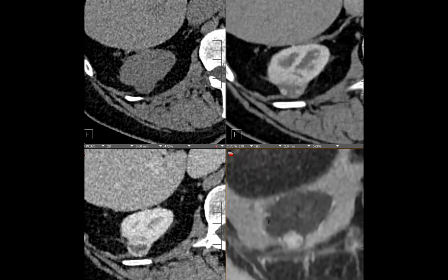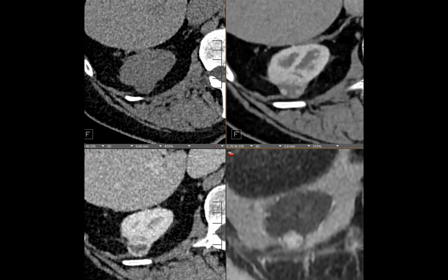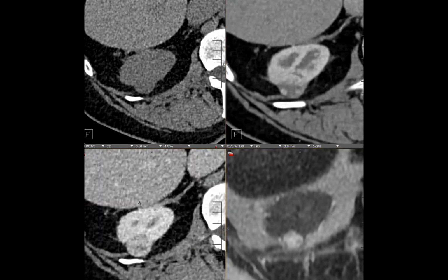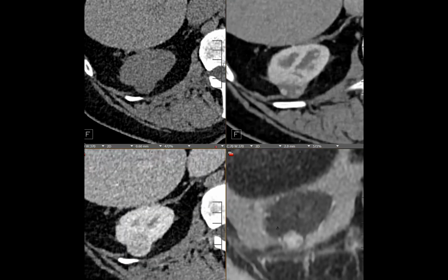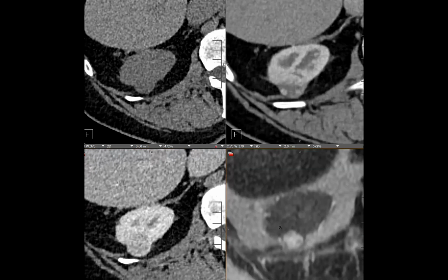I don't know. I think it would actually meet it because it's T2 bright. It's got heterogeneous enhancement. Nelly, it looks like there's some nodular enhancement. I don't know if you're thinking about a hemangioma. That's what I was thinking about. Well, of course, it could certainly be a clear cell. I feel like clear cell can look like anything and everything, and always needs to be on the differential, because it's the most common thing. I've certainly been fooled by lesions that I thought were papillary and turned out to be clear cell.